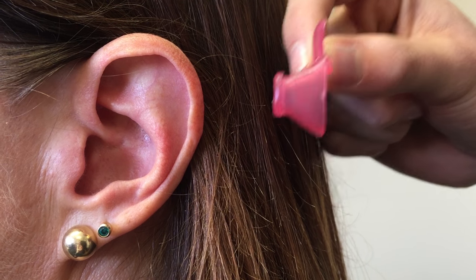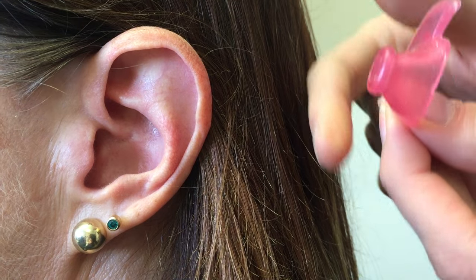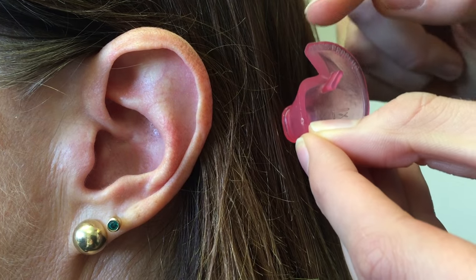This is a fixed size earplug. They come in 10 different sizes. Our aim is to get a good fit to create a seal so water can't get into the ear canal. We use the pointy bit here to block the ear and the outer bit here to hold it in place.